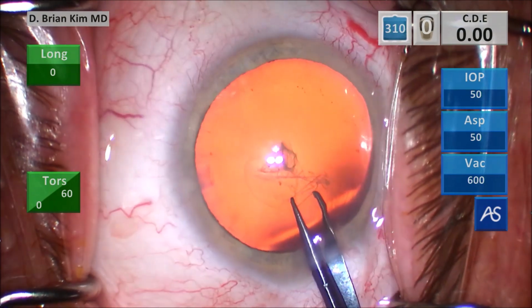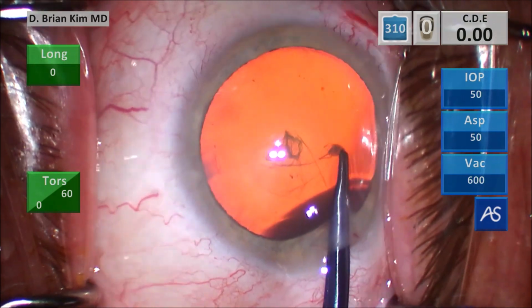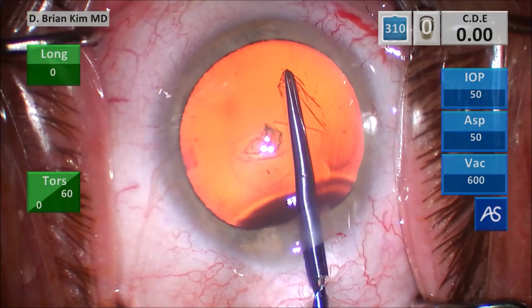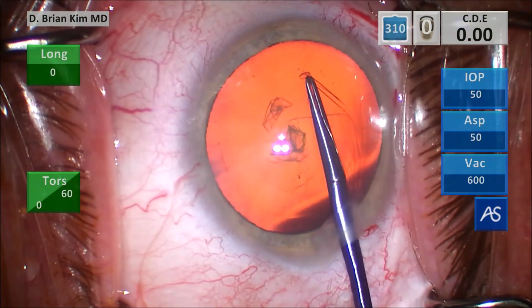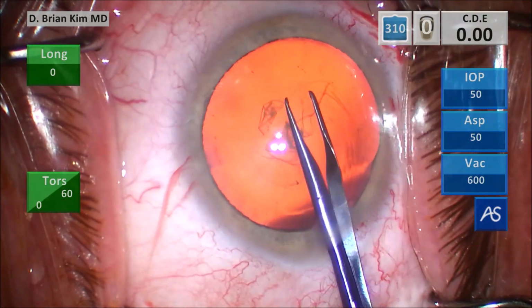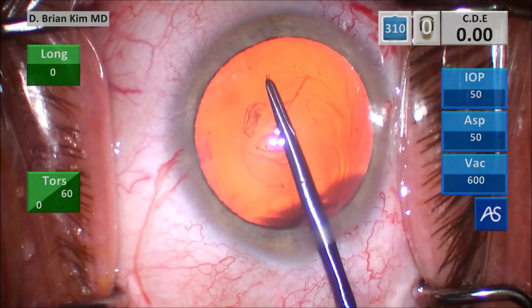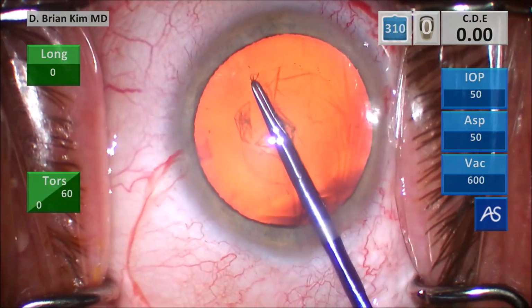Again, this is a pretty big pupil, and so that's why it's very important to use that corneal mark, which will allow you to determine the size of the rexis. Going around circumferentially, you can see excellent control with these low profile forceps. It's going nice and steady. A little bit of peripheral radialization forces, but not too bad here.